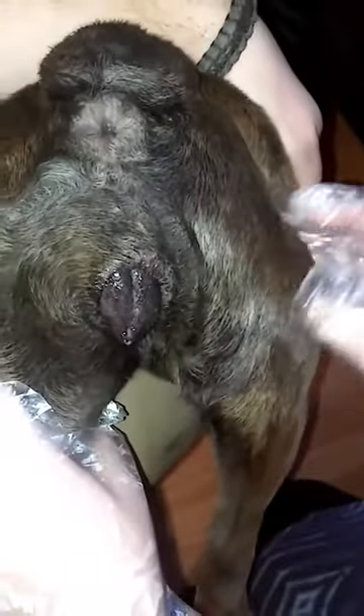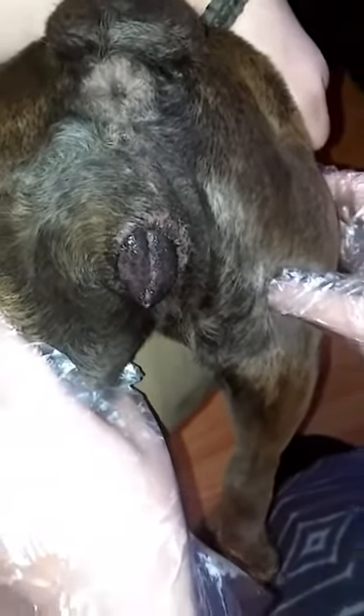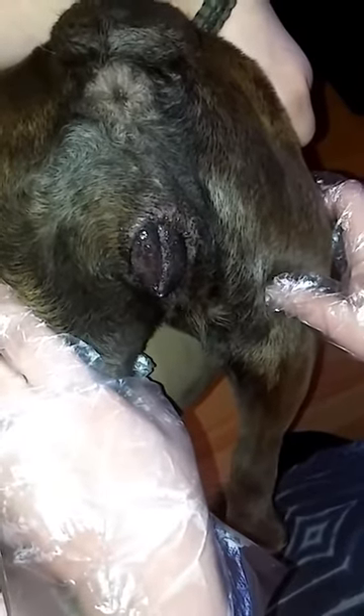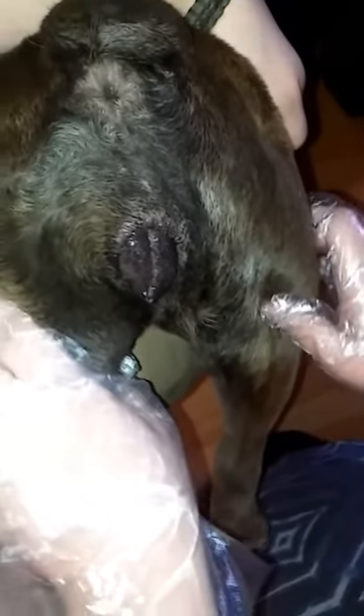And there we go. Now go ahead and elevate her like this, keep her like this for about 15 minutes. No peeing for an hour after. We just put her in a kennel or let her sleep. Hopefully this bitch is pregnant.